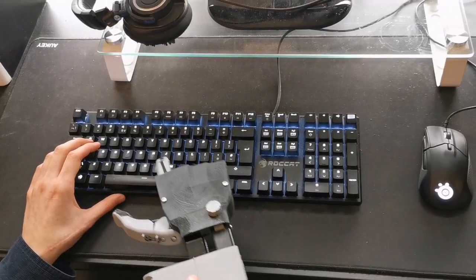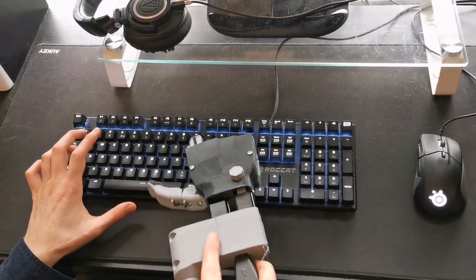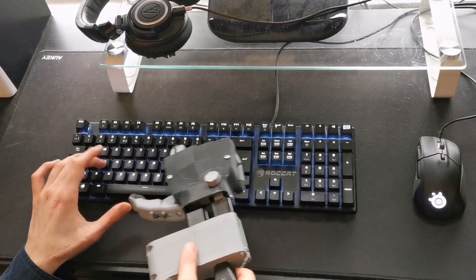Another use: by switching the thumb position, this allows users to have a pointing finger, useful for operating a keyboard.